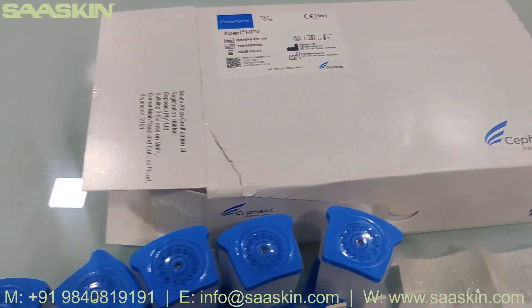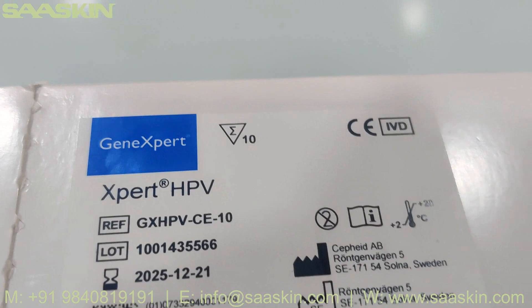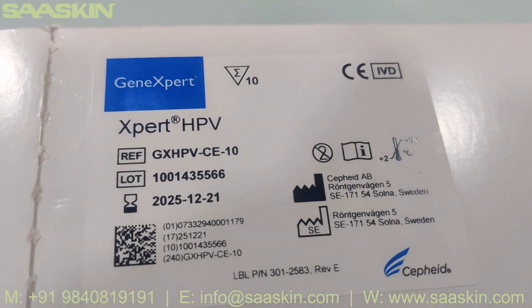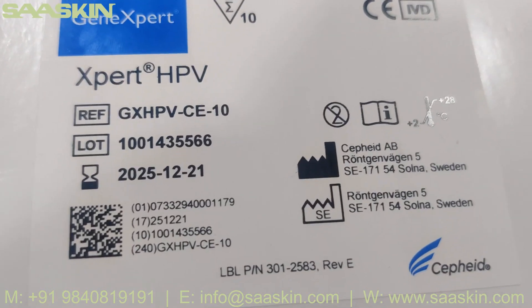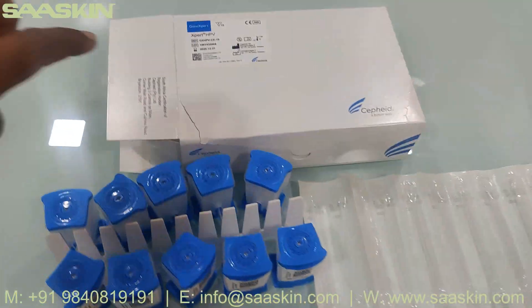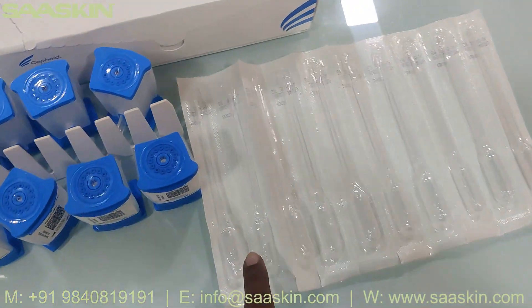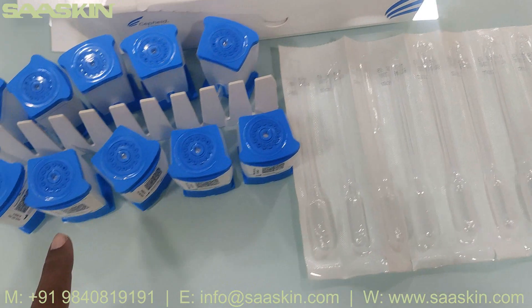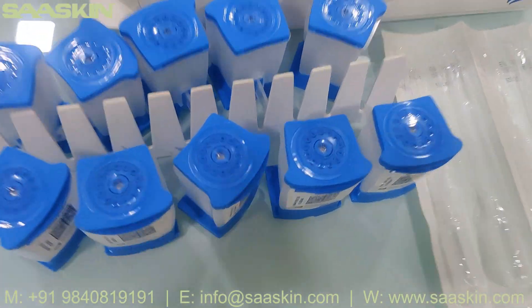Just to quickly summarize: today we have seen the unboxing of Cepheid GeneXpert Xpert HPV test cartridges, which is a 10-test kit pack. The reference part number is GX HPV CE 10. In this 10 cartridges pack, you get one CD inside, 10 capillary tubes, and 10 cartridges — that's how the cartridges look.